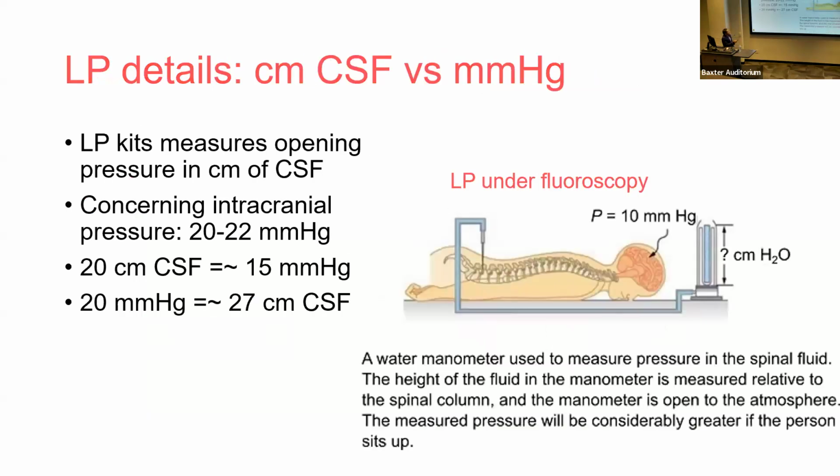Some details about lumbar puncture. Hopefully this is not a skill that residents are losing, because we saw a lot of referrals to neuroradiology to get an LP. So I think this is important for any neurology resident. You need to be confident to perform a lumbar puncture. What do you notice about this position for the residents?